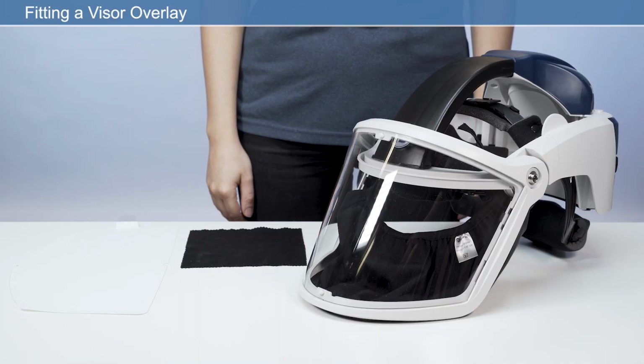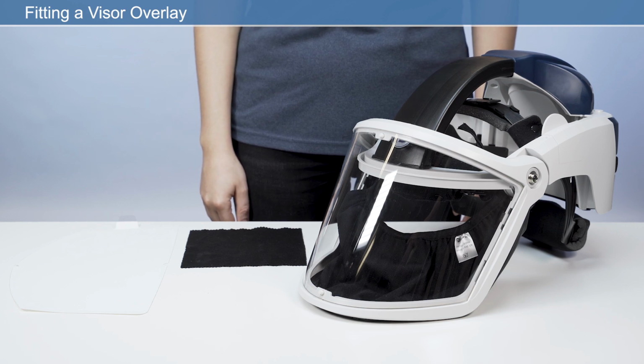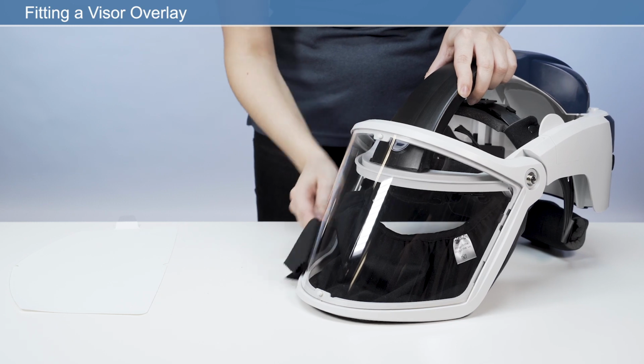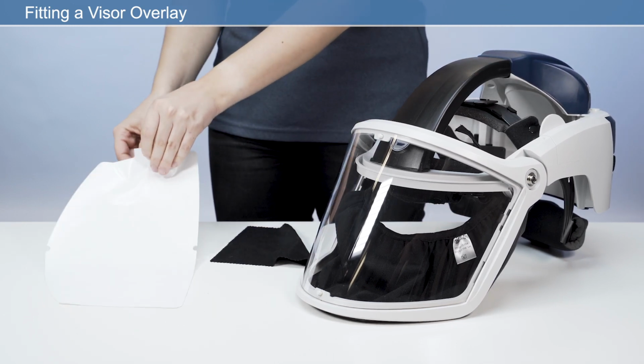Before use, it is recommended that you fit a visor overlay to the main visor to help prolong the life of the visor. With a lint-free cloth, clean the visor lens to remove any debris on the lens surface. Remove the white release liner from the adhesive on the back of the visor overlay.